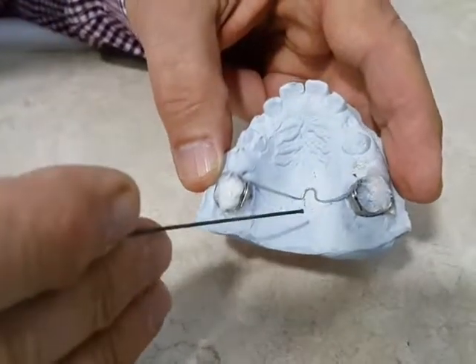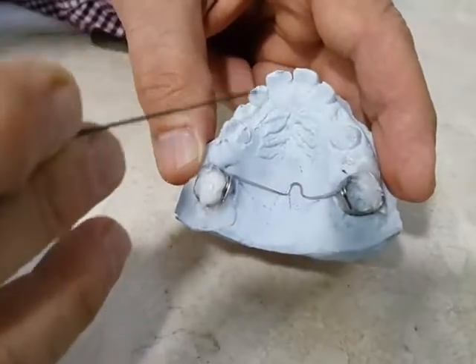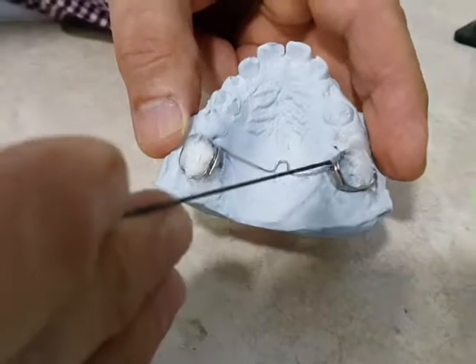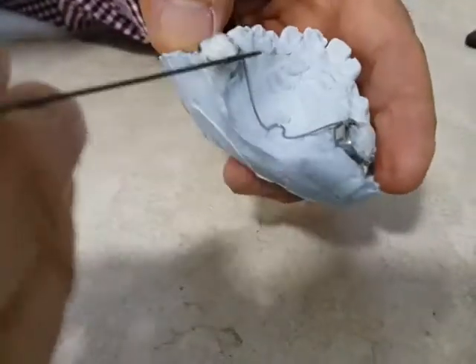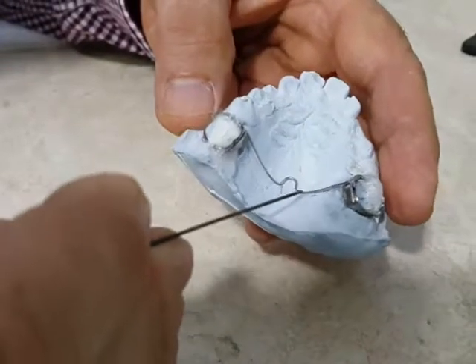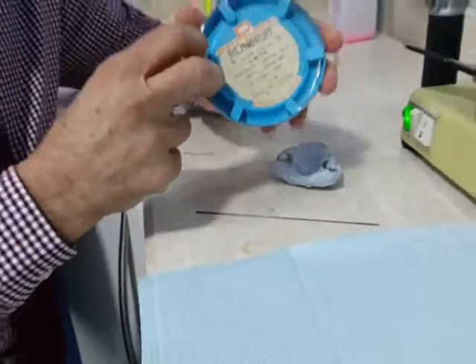Then we construct the model by pouring the model in this manner. We get the band fitted on the molar teeth. On this model, we construct the palatal arch using a heavy gauge wire arch, for example 0.9mm.